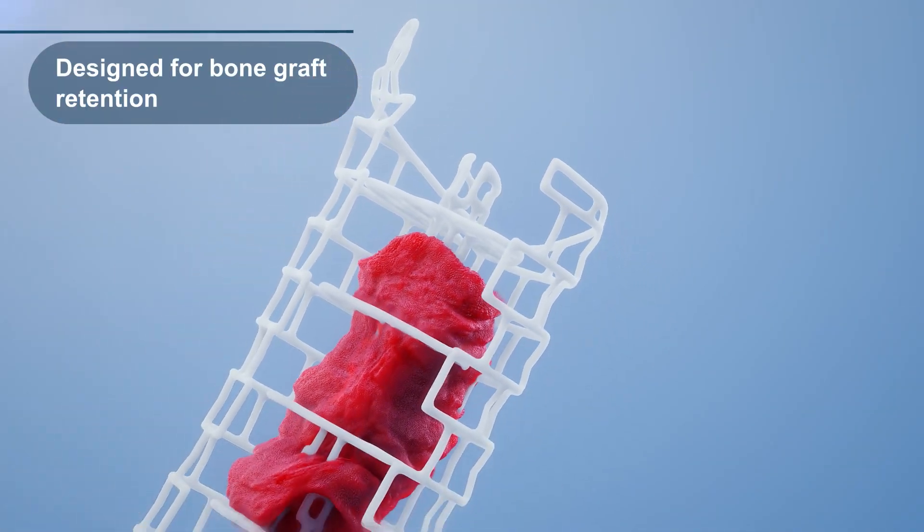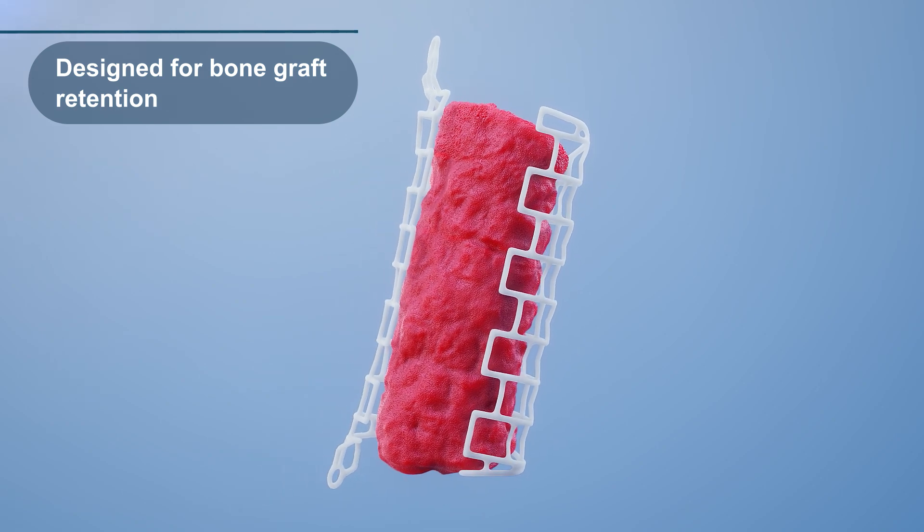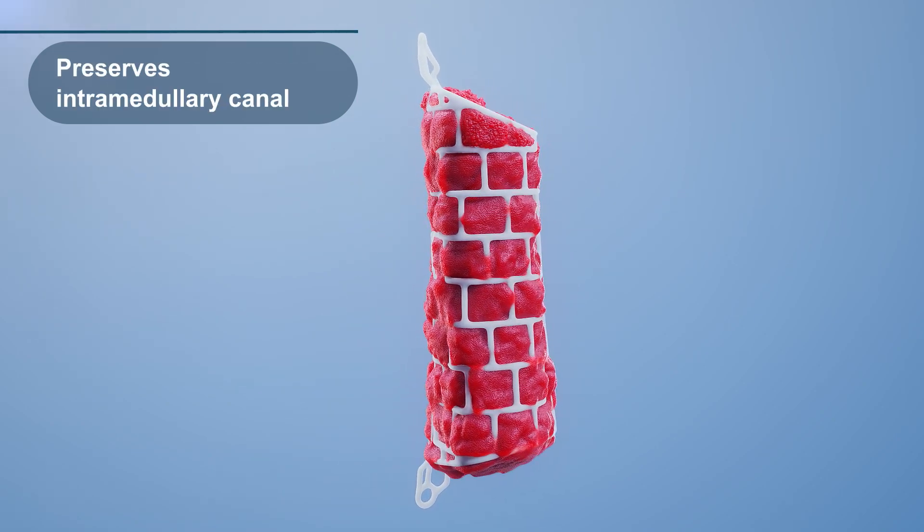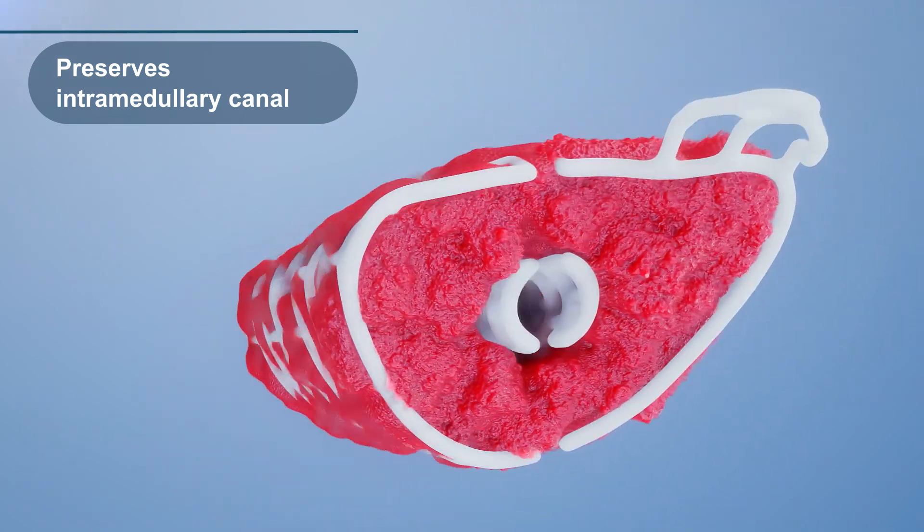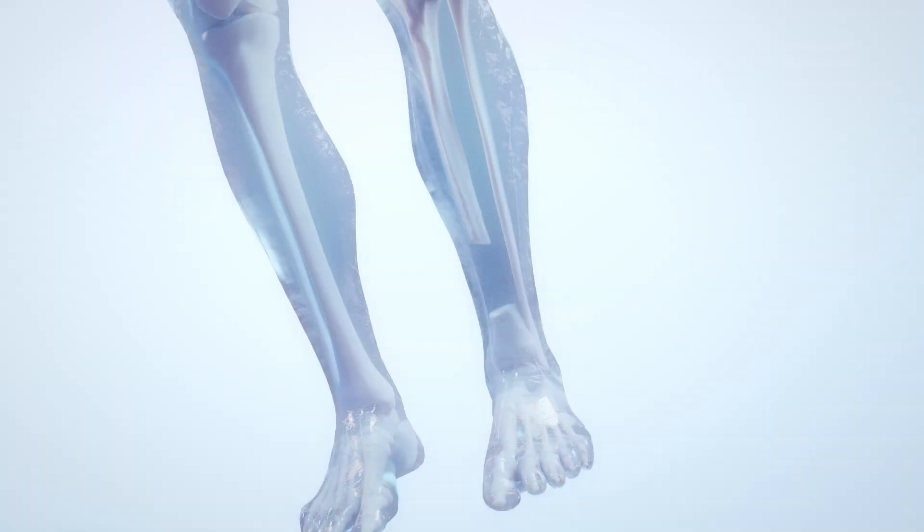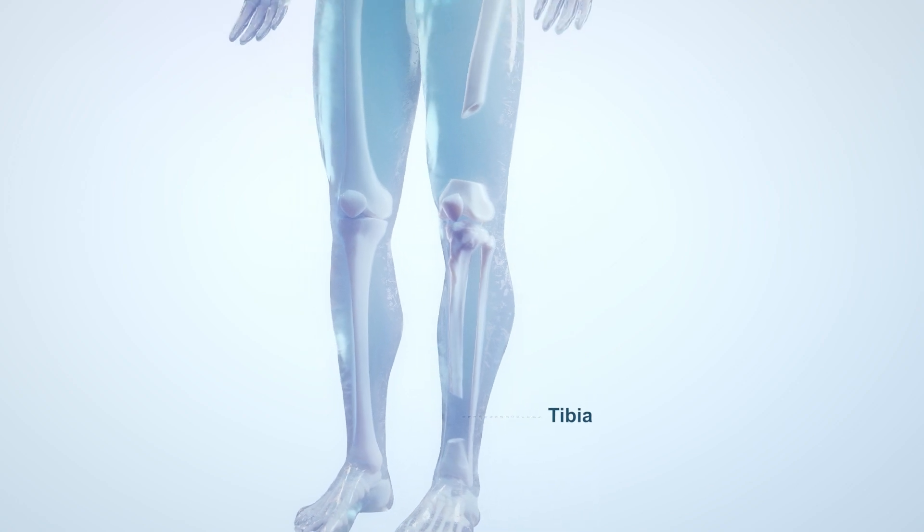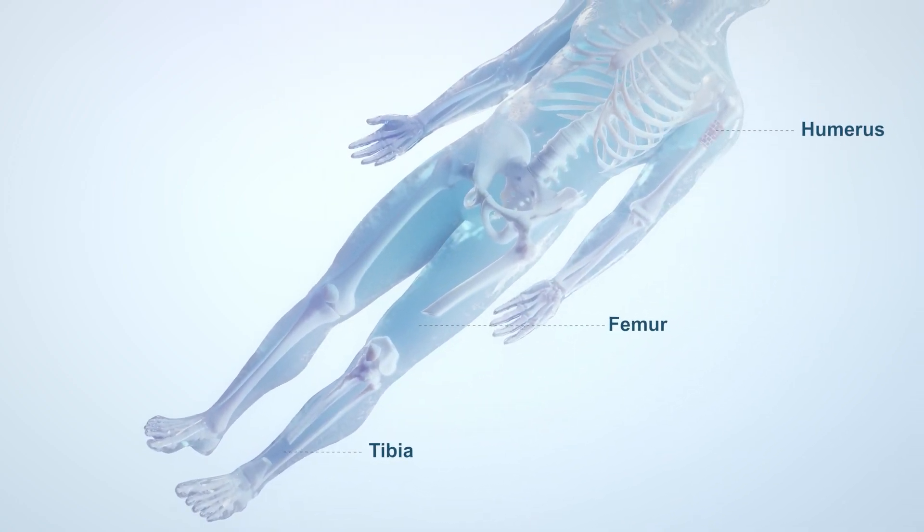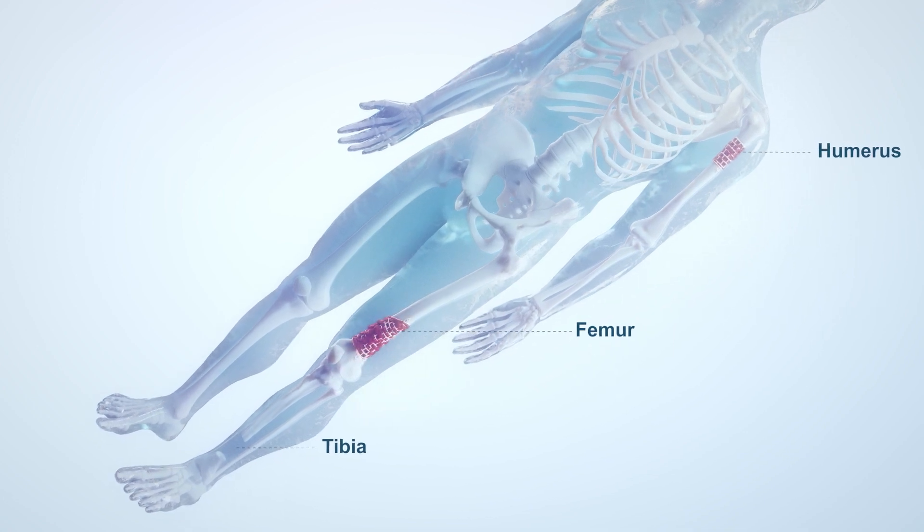The extracted bone graft is incorporated into the cage. The graft cage provides structure to the packed graft. The overall construct mimics previous bone shape. The graft cage maintains the morselized bone graft's position within voids or resections in non-articular regions of the humerus, femur, or tibia.